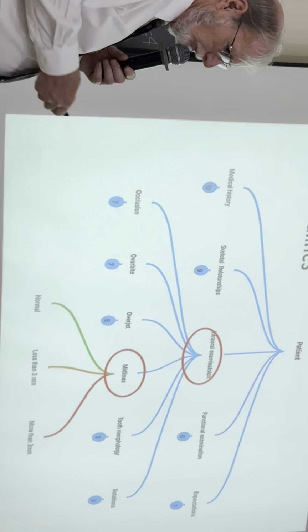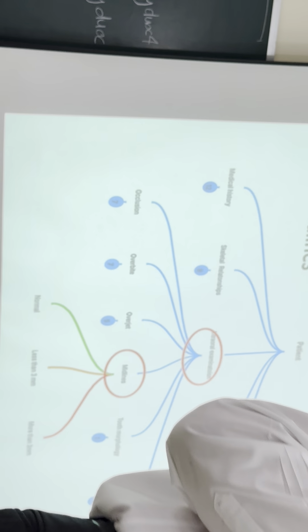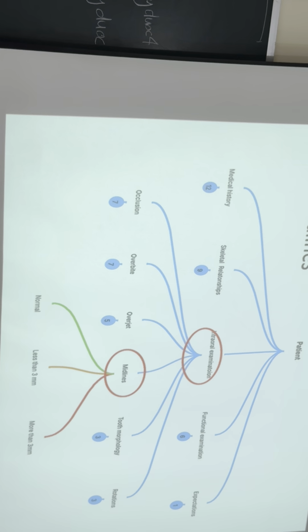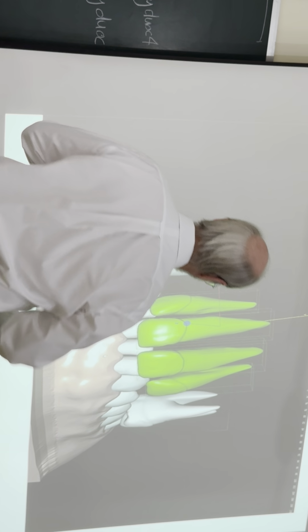So now I'm going to look at a case that I did for someone else. I did a simulation. Have a look, and I'm sure you're going to say it's an easy case, but the person who was treating it was not able to correct. I'll show it to you. See the deviations? Nothing there. Then it's pretty, nothing special. It's only like half a tooth.